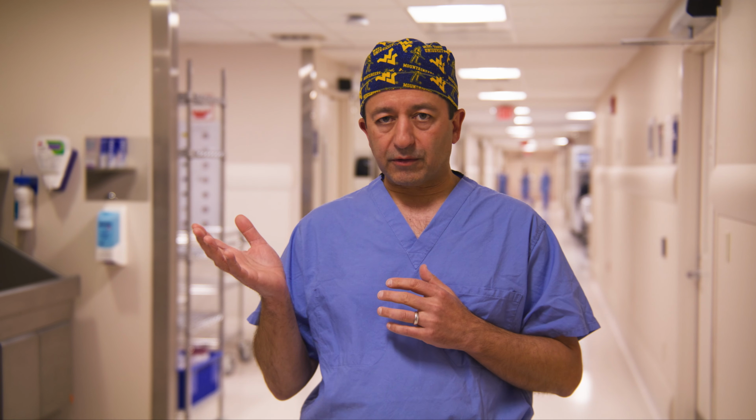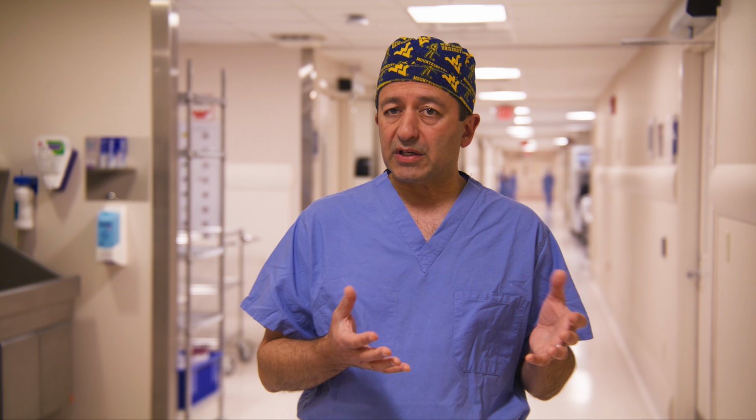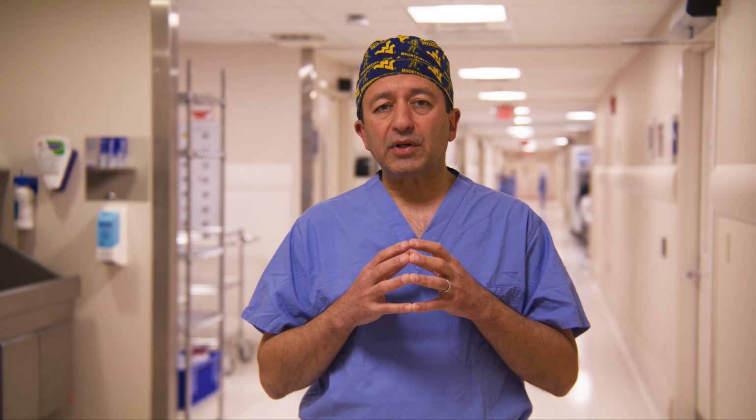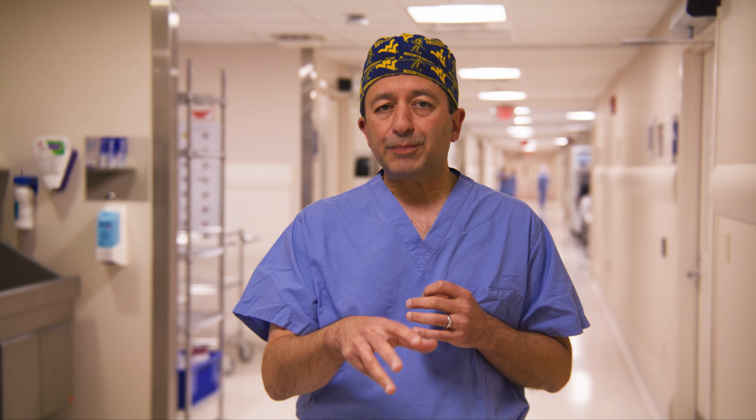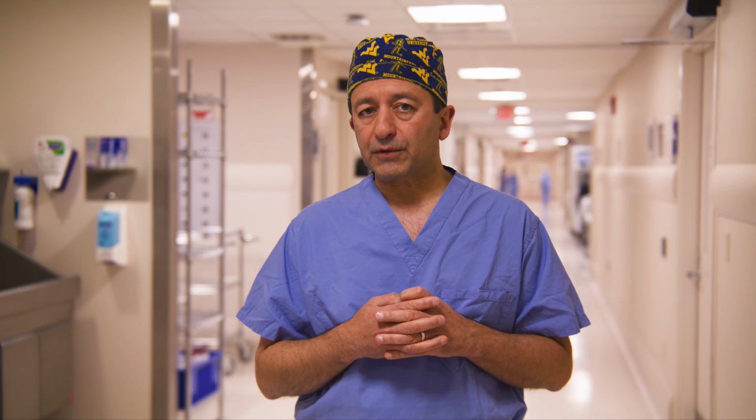Hello, everyone. So far, we've been building upon the RAVR experience, stepping up from setup, tableside choreography, and the performance of straightforward RAVR, both tissue valves and mechanical valves. What happens now when we start to approach more complex patients, such as those with bicuspid disease, where that calcium can not only encroach the sinuses, but also deeper down into the left ventricular outflow tract?